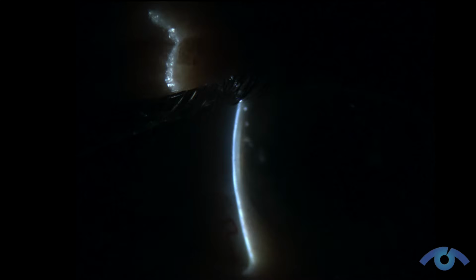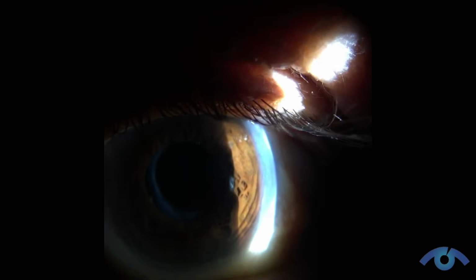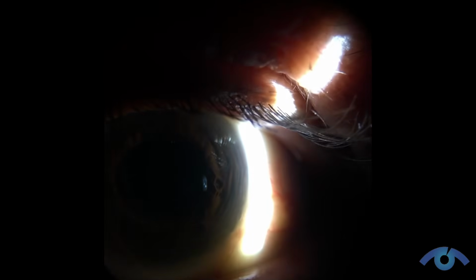you can see it hitting the limbus where the white part of the eye meets the cornea. You can see also where it hits the iris. As you bring the light in, you'll notice there's a space between where the light hits the cornea and where the light hits the iris. That helps to determine the distance between the iris and the cornea.